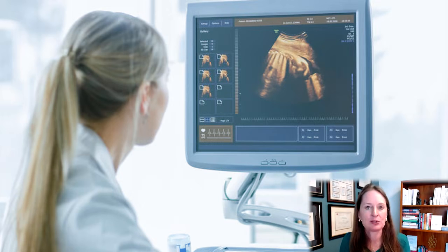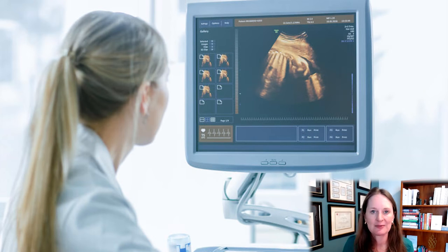So just a nice piece of information if people are thinking about access to care, lower cost of treatment. It's a way to make sure at least one fallopian tube is open. The cons of the saline sonogram is you really don't get tubal information. I know I just gave you this little trick for getting a little bit of information, but there could be subtle tubal issues that you might not be able to see. And of course, it's not as gold standard as a hysteroscopy, so there could be subtle things with the uterine cavity that you also might miss.